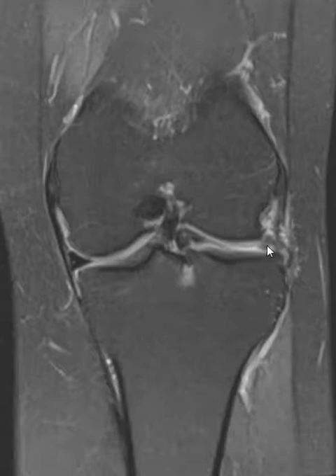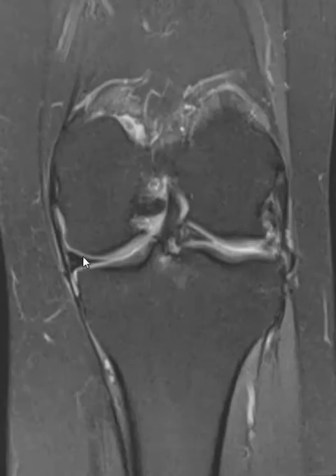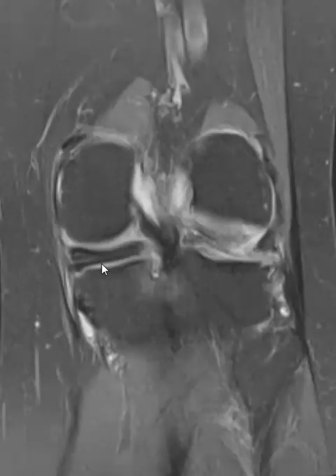This one's very easy because the meniscus is small and irregular, and the meniscus bucket handle fragment is huge, so this is super easy to see. But again, when you have a small bucket handle tear, they can be really challenging. Now on the opposite side, the medial meniscus, we have the meniscus body here looks great. It's not pseudo-extruded, so at first glance, like, hey, this is pretty good.